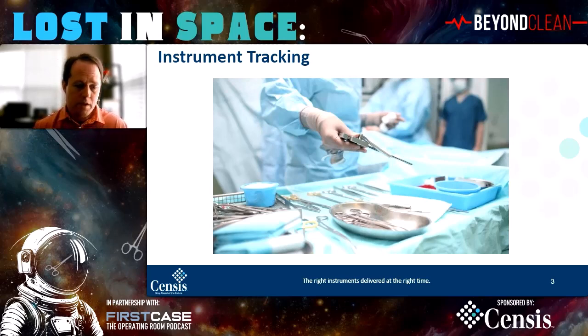So specifically, when the trays are being assembled, the technician has an opportunity at that point to say something about the condition of that tray. Typically, they're going to list, here are the things that are currently in the tray or being assembled into the tray. There's different ways that the various instrument tracking systems collect that data, but that's common to all of them.